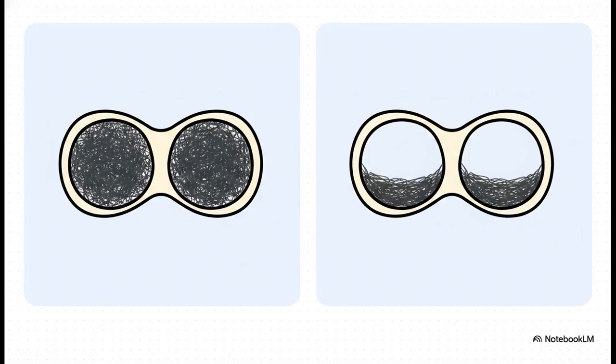In our PA skull evaluation, remember, the orbits were completely filled and obscured by the petrous ridges. But look at the Caldwell evaluation. The PA axial demonstrates those dense petrous pyramids, or ridges, lying in the lower third of the orbit. That 15-degree angle dramatically drops those dense ridges down, effectively clearing the upper orbital view for the radiologist to evaluate. It's such an elegant mathematical solution to a biological obstacle.